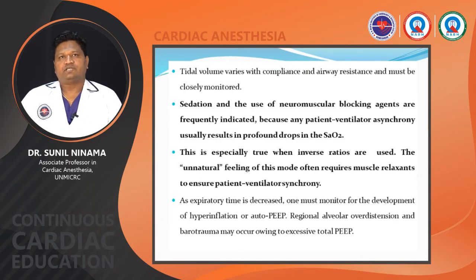In pressure control ventilation, the tidal volume varies with the compliance and the airway resistance and must be closely monitored. Sedation and the use of neuromuscular blocking agents are frequently indicated because any patient-ventilator asynchrony usually results in a profound drop in SaO2. This is especially true when inverse ratios are used. The unnatural feeling of this mode often requires muscle relaxation to ensure patient-ventilator synchrony.